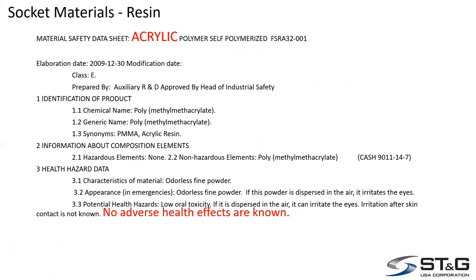When we look at acrylic resin, it is very familiar to our industry. A lot of people use it, and for the most part, it's not as toxic. The one thing is, it is very stinky, partly because some of the manufacturers actually add an additive to perfume it so that you can smell it, so that you know that it's present.